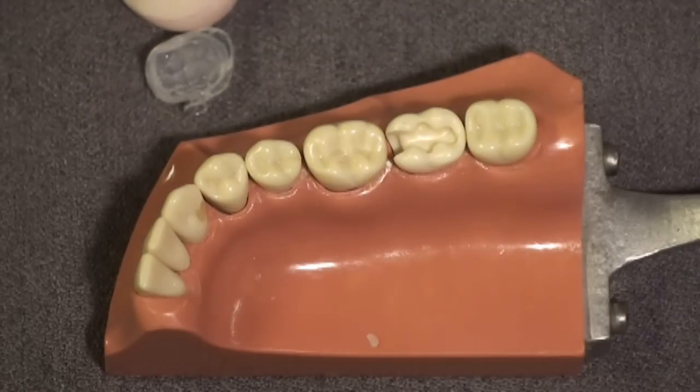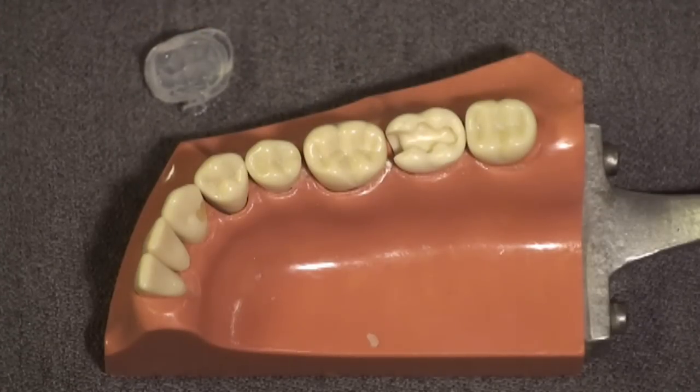Here's the custom matrix we're going to use later in the procedure. You can place it on the bracket table until it's needed after you place the last increment of composite. We've now cut our cavity preparation the way we normally do, and you can place any liners or bases as you care to.